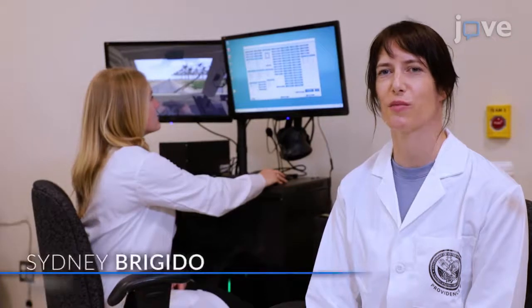Demonstrating the procedure will be Sydney Brigido, a research assistant from my laboratory. Sydney will assist with the various steps of the protocol.